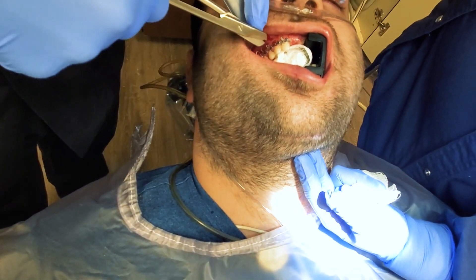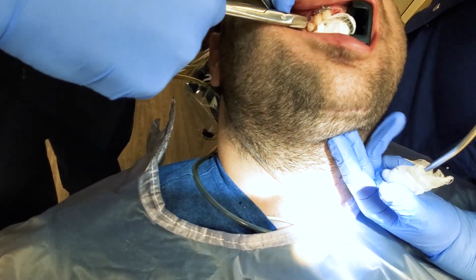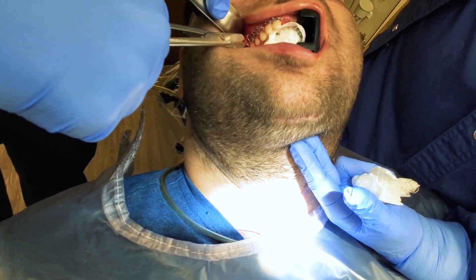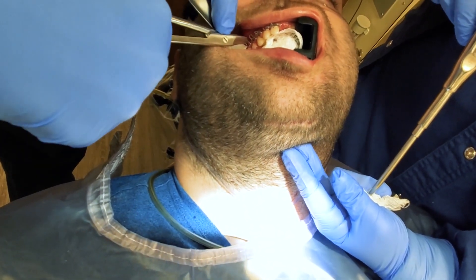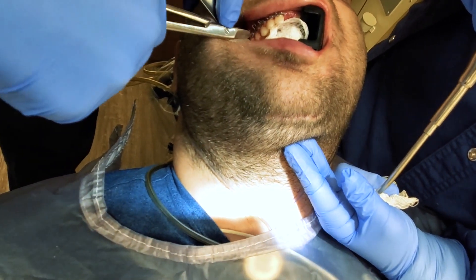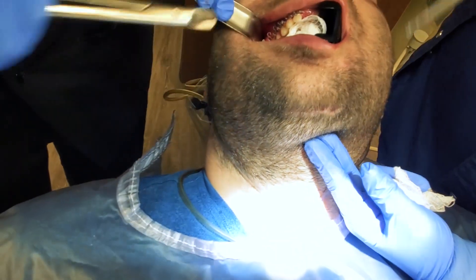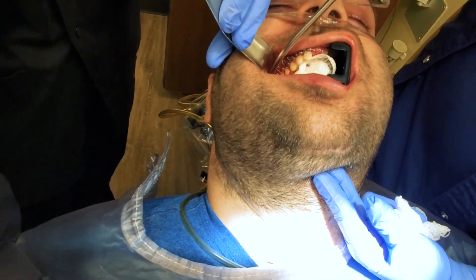There you go, that's how it's supposed to work — it just clips the wire. Clip the wire, clip the wire, clip the wire. I think I was successful on that one. Now that the wires are clipped, we need to remove the wires.